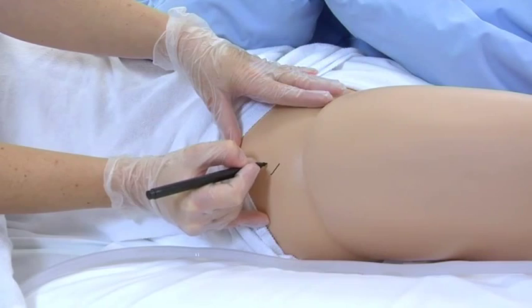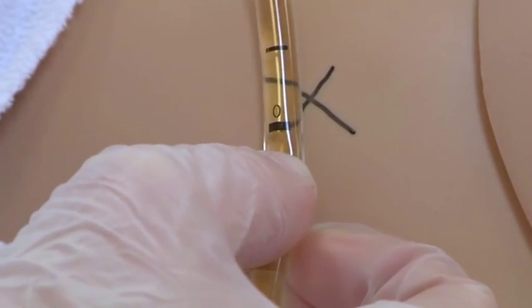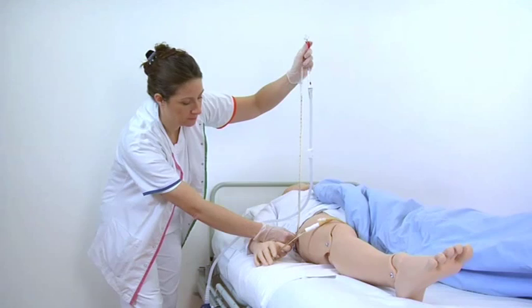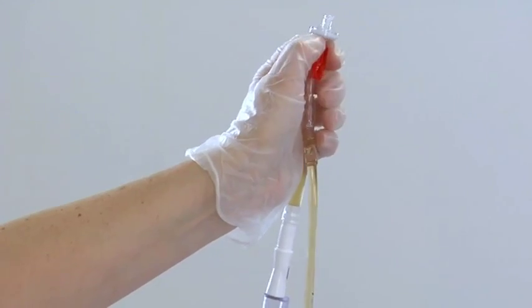Make a reference point on the hip of the patient at the mid-axillary line. Hold the zero point of the unometer abdo pressure at the reference point. Open the red clamp.